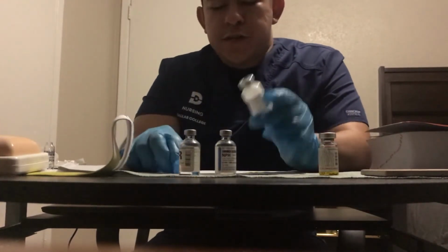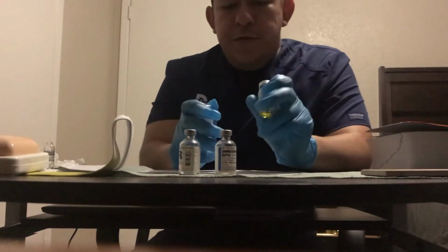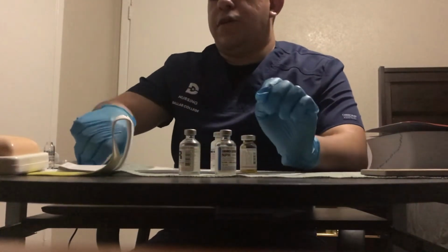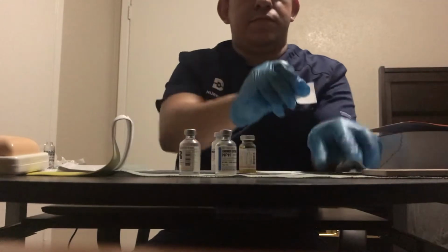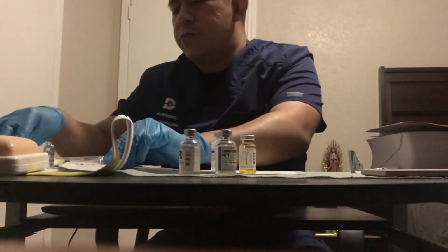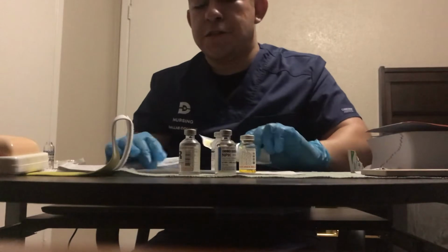And I'm going to reconstitute with the 2.5 mLs of sterile water. So you're going to want to grab your vials, pop the tops off, grab an alcohol wipe, and wipe the tops of the vials. Dispose of that. And then we're going to grab a 3 ml syringe and a 23 gauge needle.